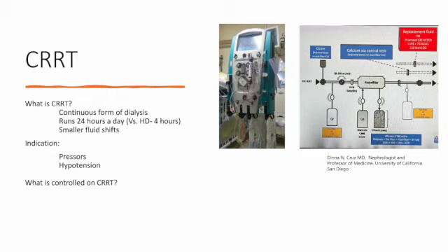So what's the mechanism of CRRT? Well, the mechanism is actually complex, but the summary is that in patients on CRRT, blood flows continuously from the patient through the CRRT machine and passes through a filter, and in the filter a gradient is created using dialysate solution. And via this gradient, electrolytes and fluid are removed, and by deciding which dialysate to use and what fluids to give back before the filter and after the filter, as well as which Prismasol solution to use, which is the solution that's given back to the patient, you can control the fluid balance per hour as well as electrolytes.